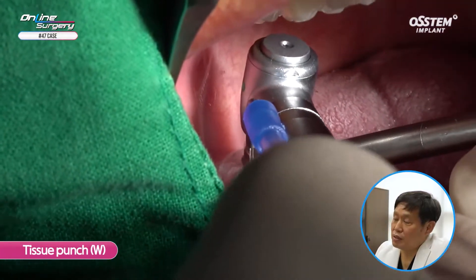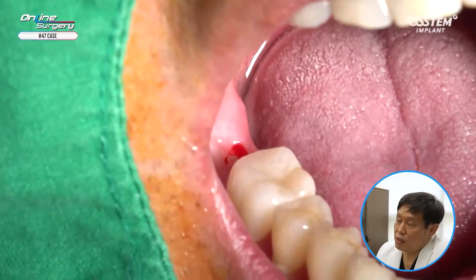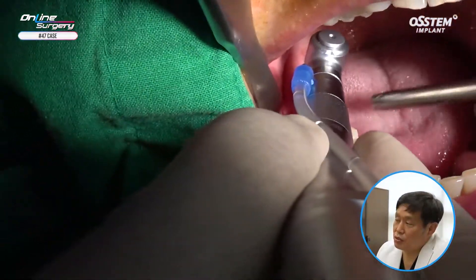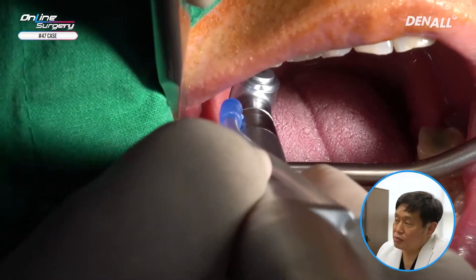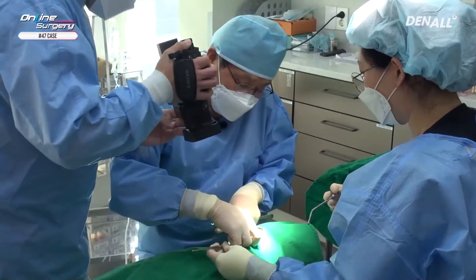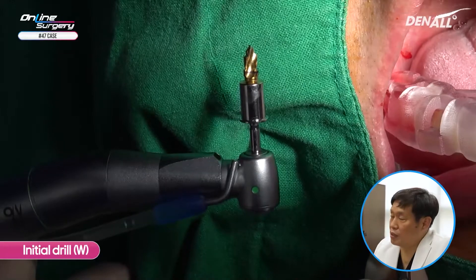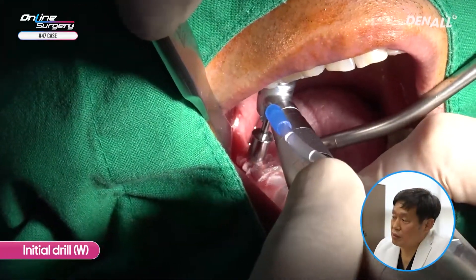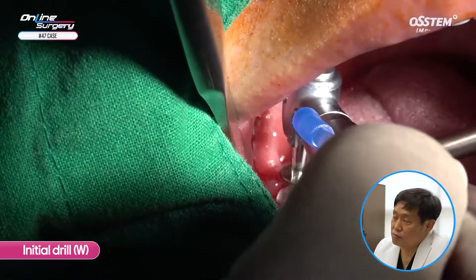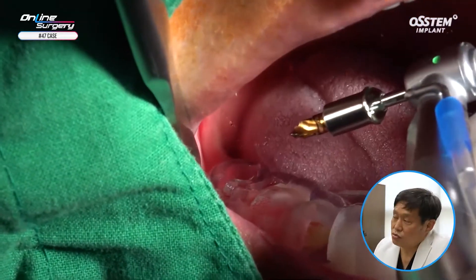A wide type tissue punch was used. In number 47, the gingiva is being removed. The template is removed and I'm checking whether the gingiva has been removed properly. As you can see, the punch is not thoroughly done, so the tissue punch is going to be used once again to remove the gingiva thoroughly. One guide template is repositioned and the initial drill is used for drilling — a wide type gold rim initial drill. Initial drilling is complete and then full length drilling is done.